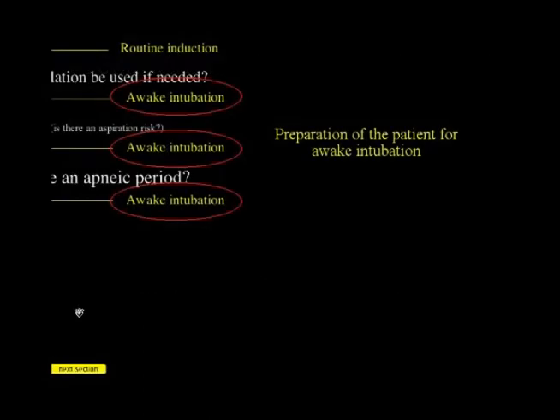So we're going to talk about preparation for awake intubation. Now, first of all, we're talking about preparation. We're not talking about local anesthesia, okay? We're not talking about blocks. We're talking about preparation of the entire patient.